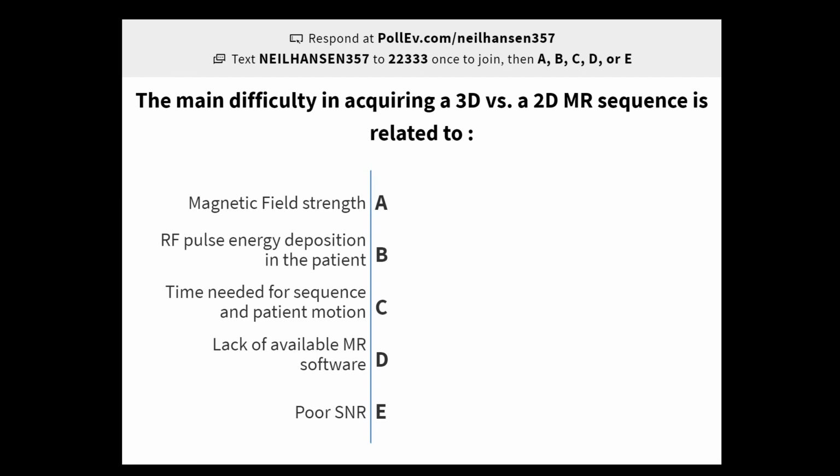The correct answer is time needed for sequence and patient motion. So the main difficulty for 3D versus 2D imaging is it takes a lot of time.